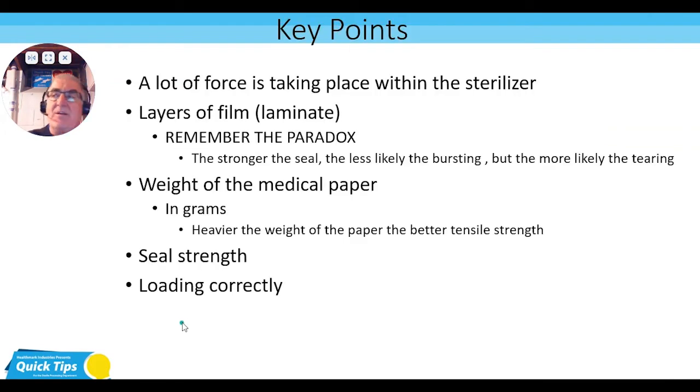So let's go through some key points that are very, very important. We showed you pill pouches — not containers or wrapped items. The reason I used pill pouches is so you could see the force of what something is going through in the steam sterilization process: the energy of the force closing in, the vacuum pressure, the temperature, and the water vapor and condensation. This is what the items are going through.